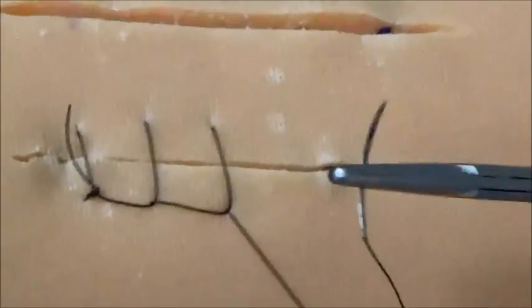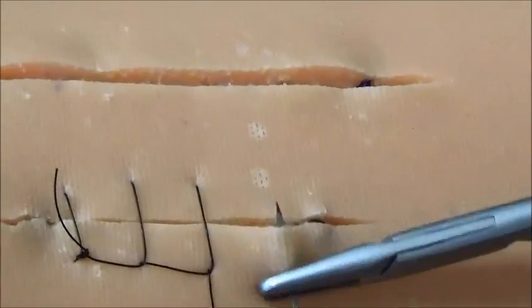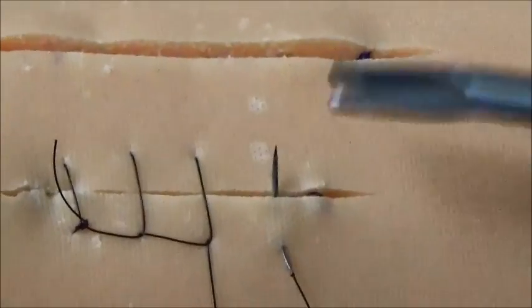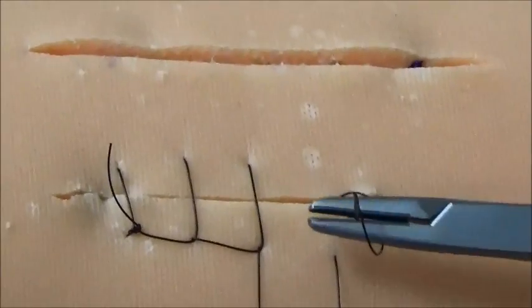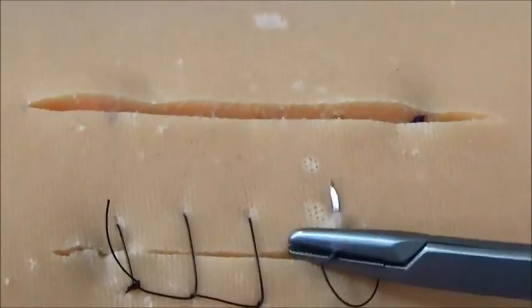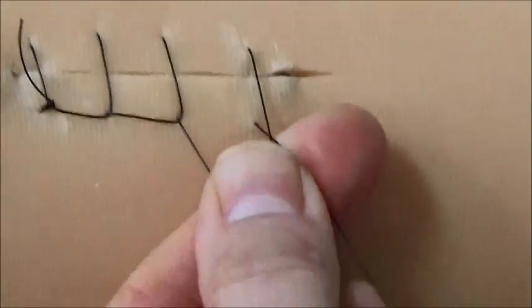When I get to the end of the suture line, there are a couple variations on how to finish it. The one that I like is to reverse the direction of the needle and the drivers and come another 8 to 10 millimeters down from my cut edge. Do the same on the far side, backhanding my needle, and draw it up. And then go ahead and tie that to the loop.